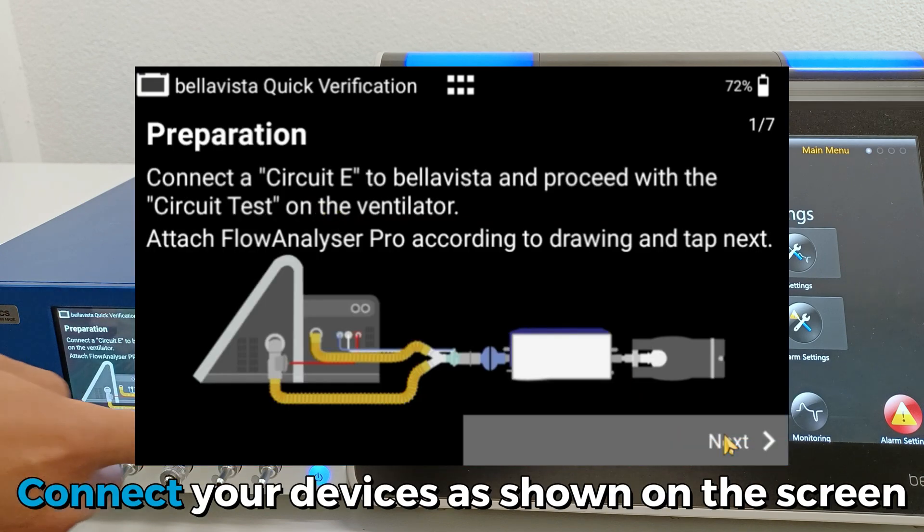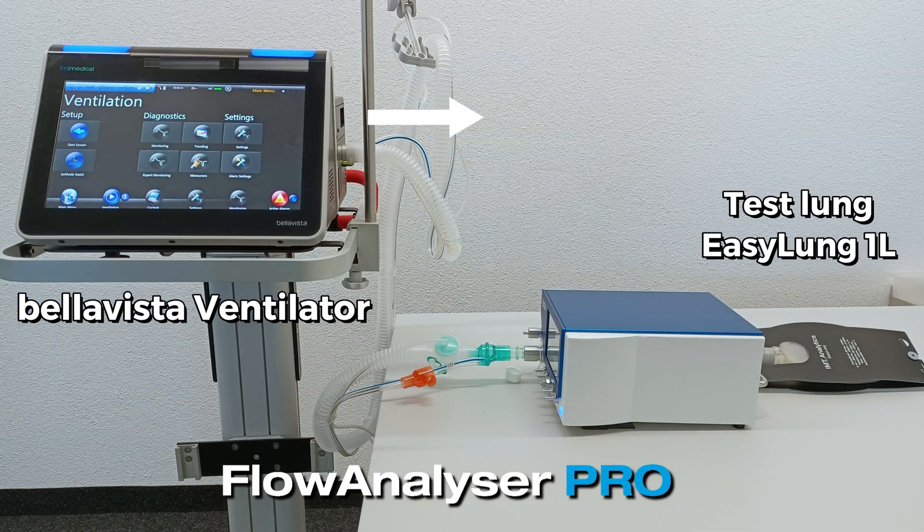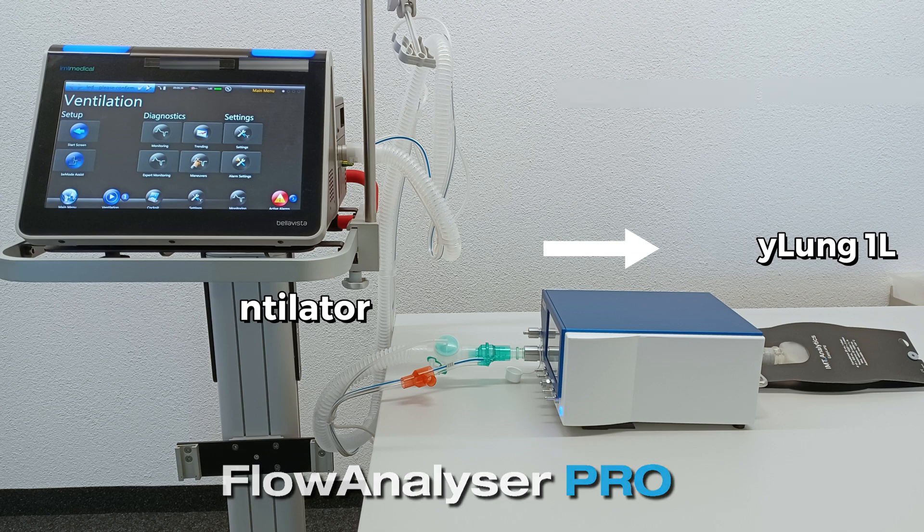Connect your devices as shown on the screen on the Flow Analyzer Pro. Connect the BellaVista ventilator using patient tubing to the inlet of the main flow channel and connect a test lung to the outlet. In this case, we use an EasyLung 1L.